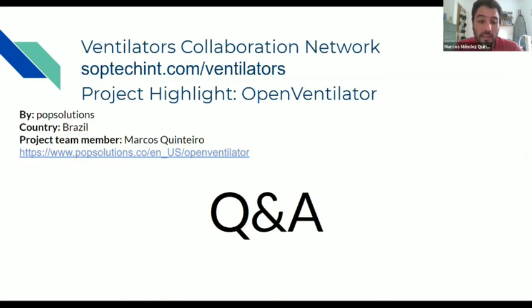One of the guys in Argentina made a very good contribution. He said the problem with the filters is that they have to be on the face and they have to be very large, because when you have 1 micron, 2 micron filtering, the air doesn't pass easily.